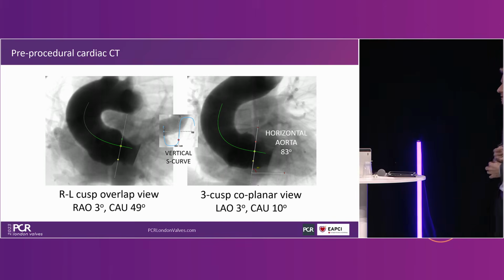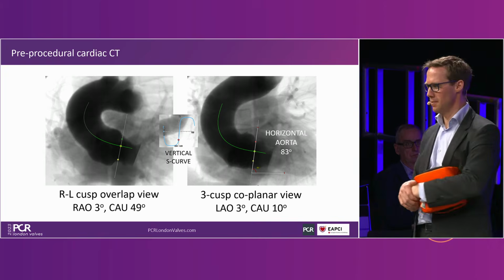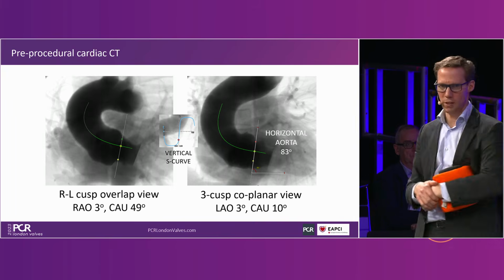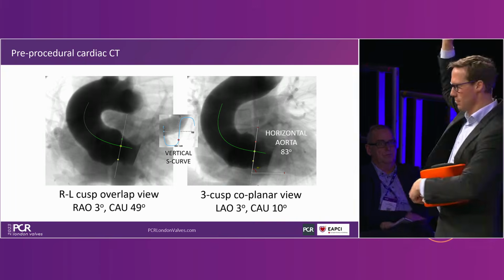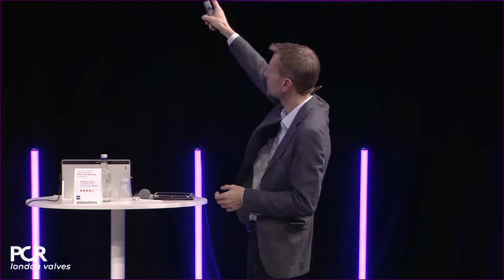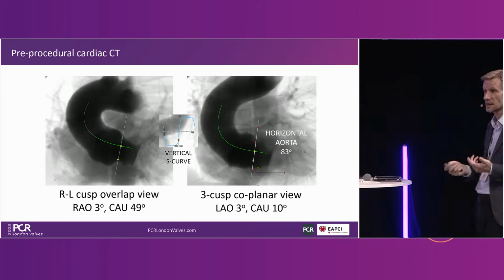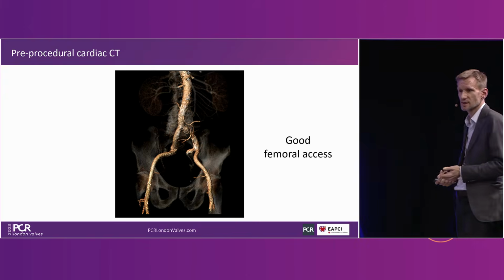So who would take an Evolut PRO+ for this? Yeah, I wouldn't either. Who would take an Evolut FX for this? It's a different system. It's more flexible. So look, I thought it was a good case for it still, and I wanted to test the system too, and I thought it was a good choice for this patient. But you see, even just on that aorta, it's enormously curved, so it's a real test for the system.